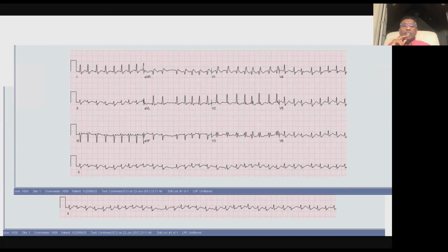And then now you have to decide, is this AFib with a fast ventricular rate? And if so, it looks a little bit wide. Is this AFib conducting with bundle branch block? Or is it some kind of irregular VT? I would grant you right off that it doesn't look that wide, does it? It's probably barely 120 milliseconds. So just about a wide complex tachycardia, okay?